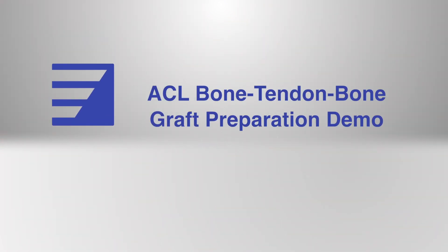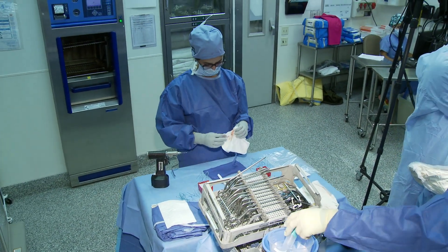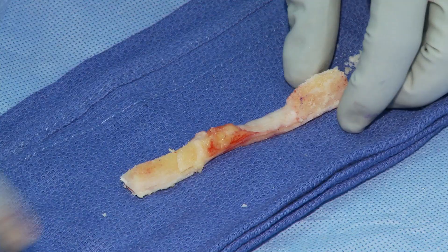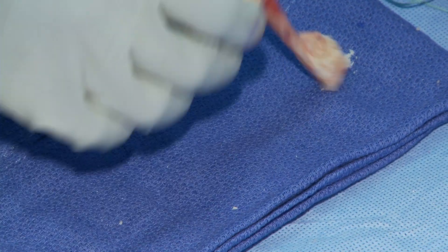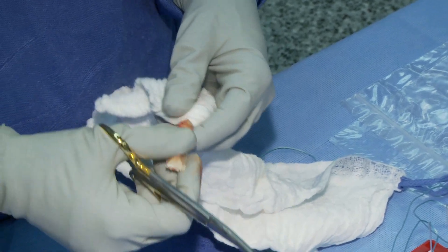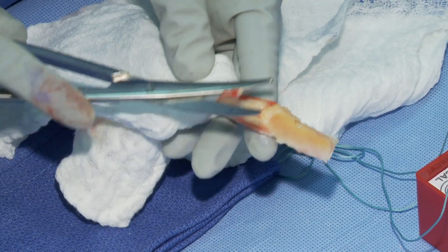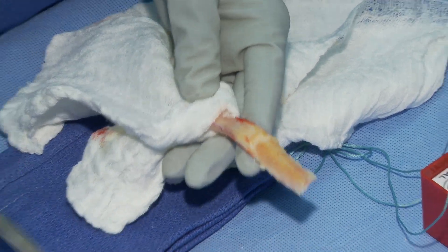One of the most important things to remember during this stage in the procedure is that you are now responsible for the patient's graft. When the attending is about to finish the harvest, make sure that you have a hand on the graft at all times and tell him that you securely have a firm grasp on the graft so that there is no confusion and it doesn't accidentally get dropped.